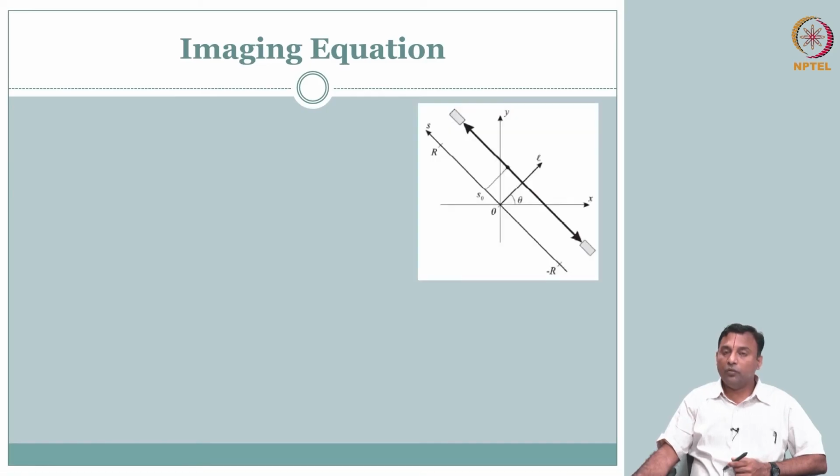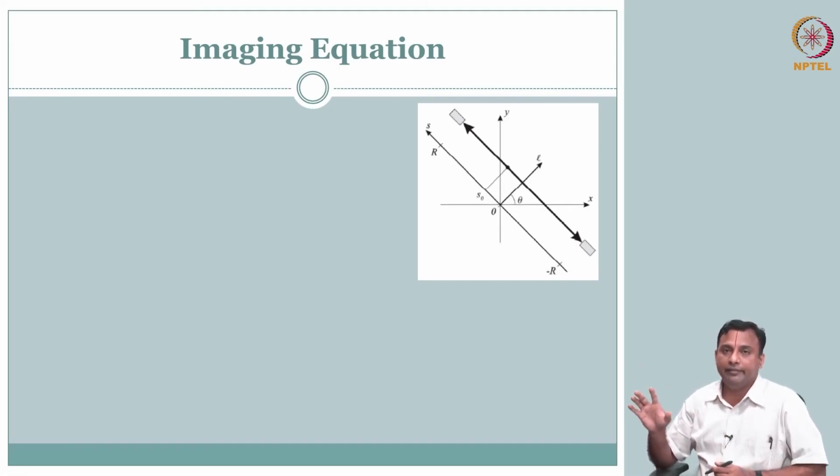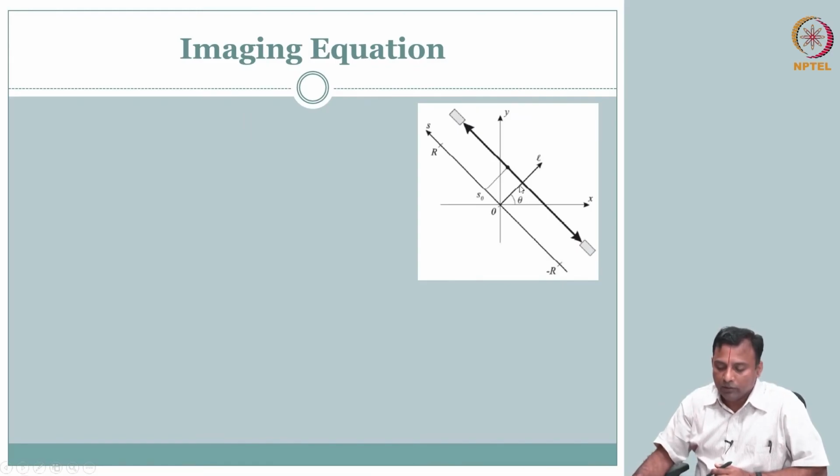So, we know it is a similar projection, you get the data similar, right, the detector, that part is not much different. What is different here is the arrangement. So, we need to make sure that we write our equations corresponding to the acquisition geometry for PET. So, here for example, what you are doing, oh, you have your coincident detector. So, this is what we are interested. We are interested in the line that is going here. So, how do we write this line in terms of L theta?